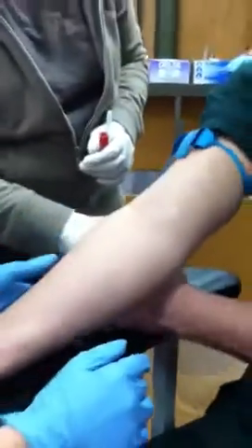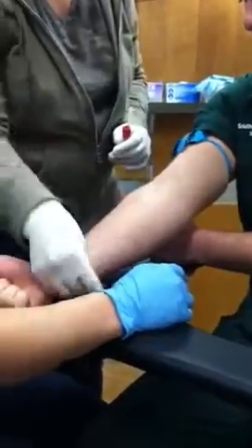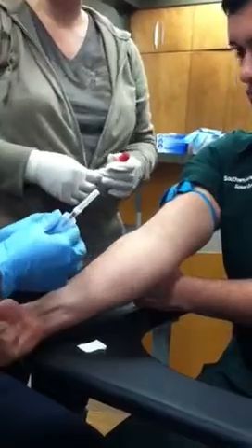Put this one underneath here to slightly hyperextend — it'll have a better angle for this. Do you see which way the vein is running? That slight angle, right? So you want to make sure and go at that angle.